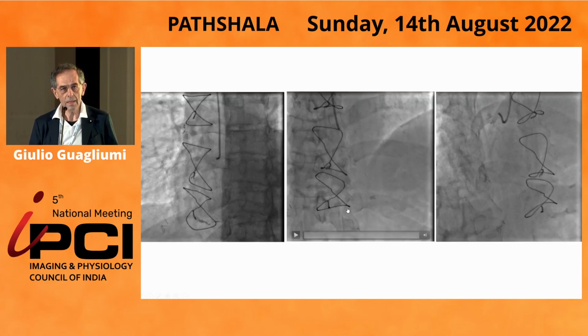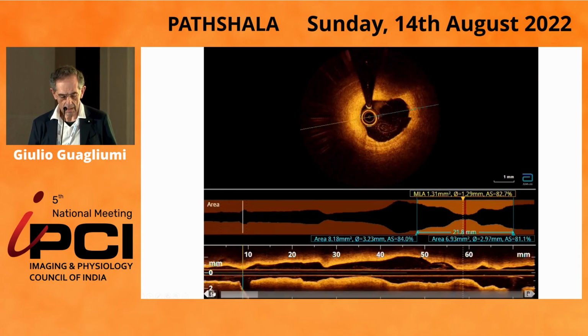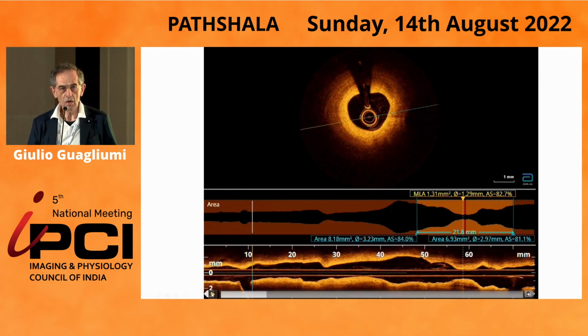The original, the native right coronary artery that previously was patent was totally occluded. While in the radial arterial graft on the LAD, we have 2 different locations of significant reduction of the caliber. The first one was distal and more uniform before the graft insertion, and then there was one more proximal, quite severe.